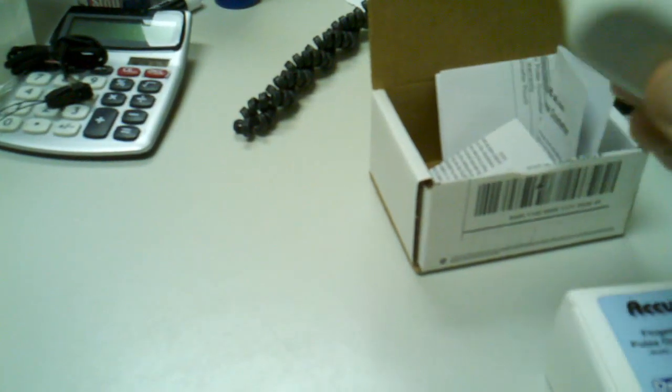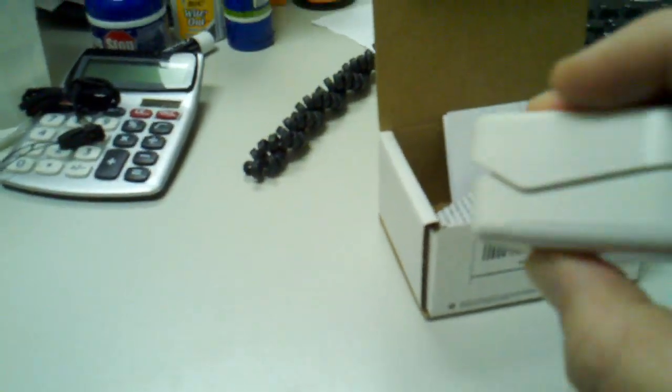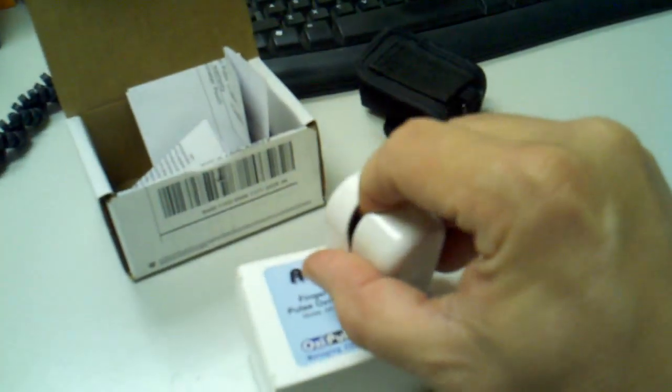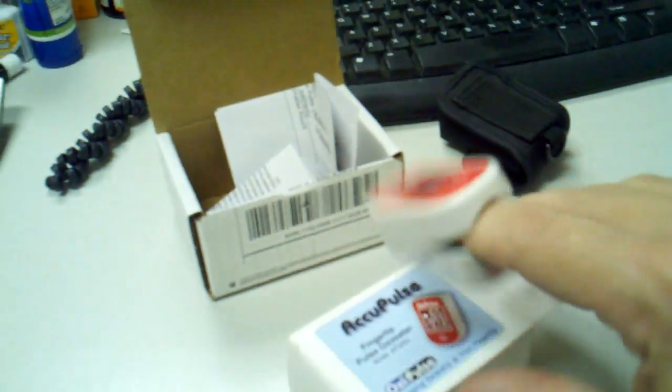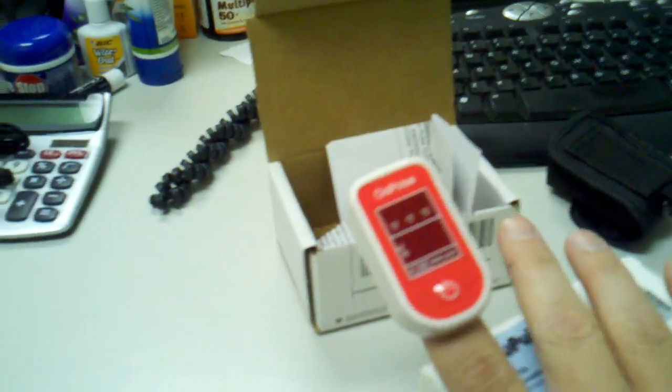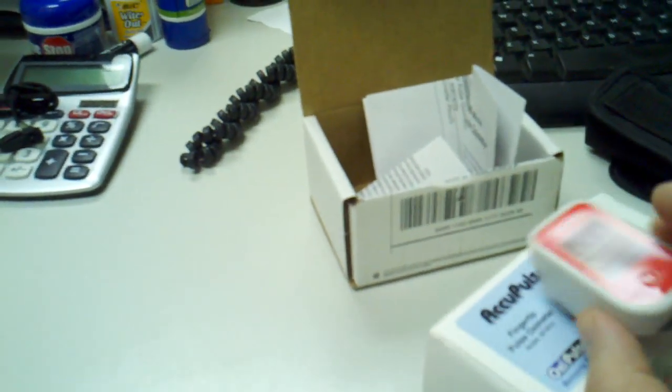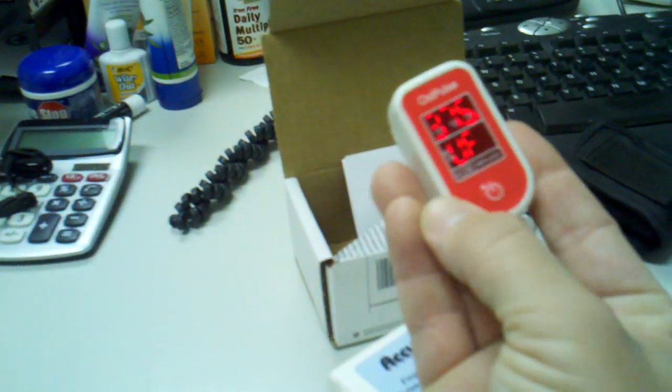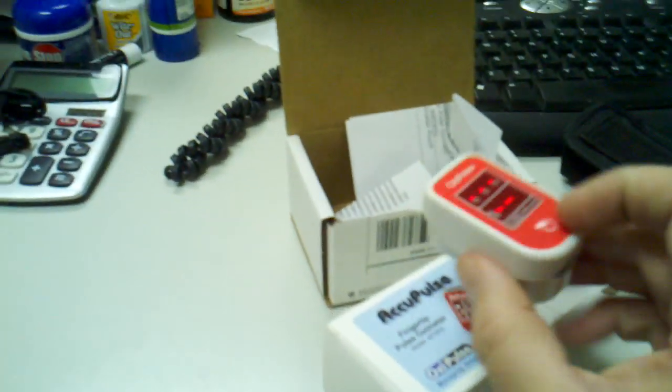All you do is take it, and I'm going to do this with one hand so you can see how easy it is. You just slide your finger in there and you're ready to go. You have to turn it on by pushing that button, and you can see that it's ready to go.